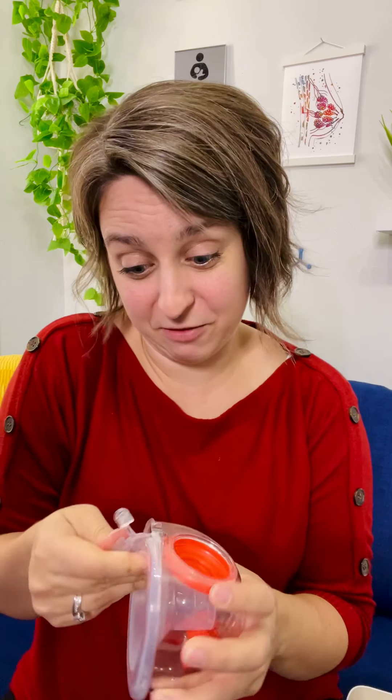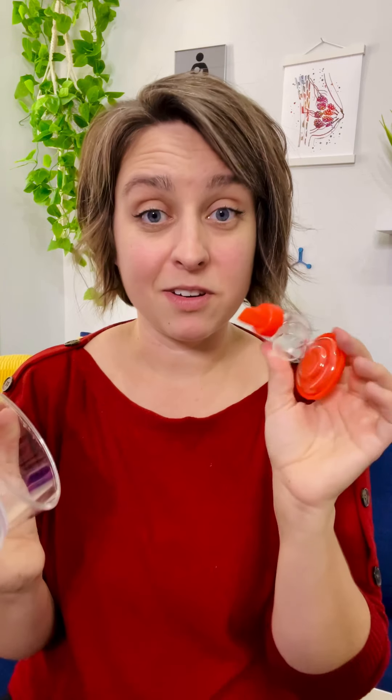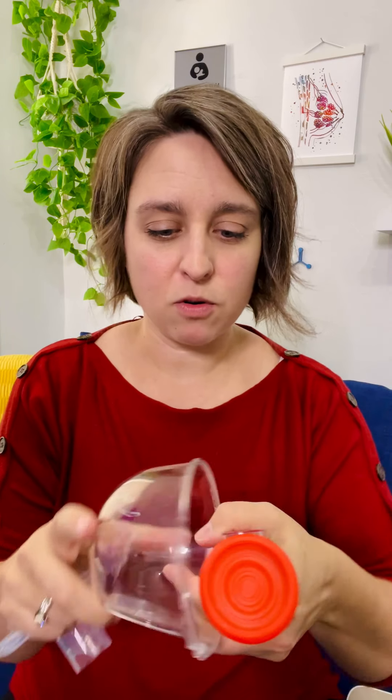First of all, there are some red parts — I don't know why, but it's cool. That's the backflow protector. You've got a valve on there. You will need to get those parts specifically from Legendary Milk. This cup holds seven ounces — it's a little over 200 milliliters — so it'll hold plenty of milk.